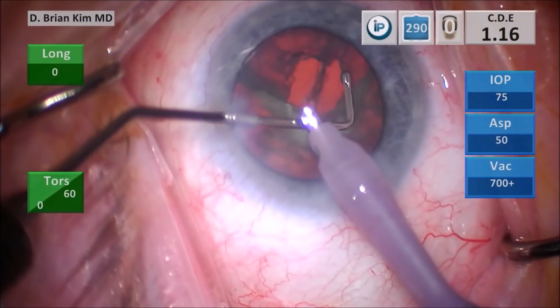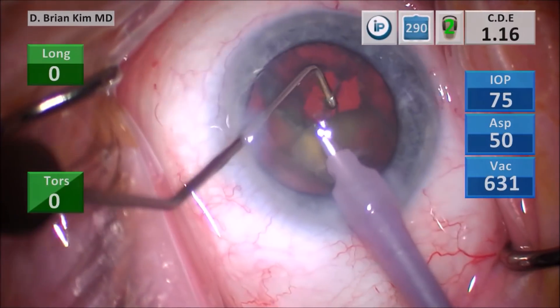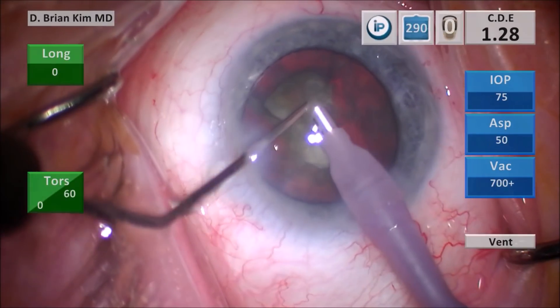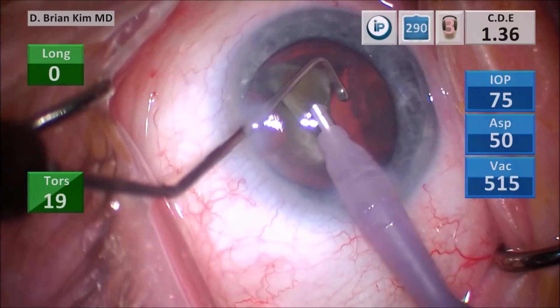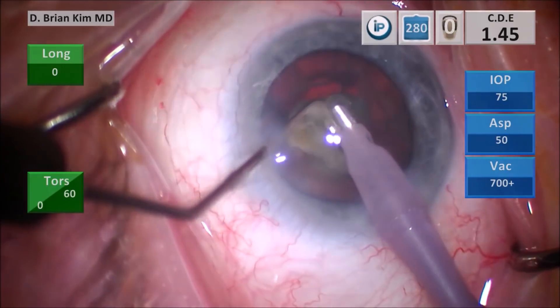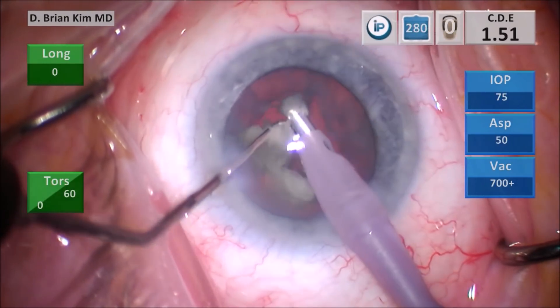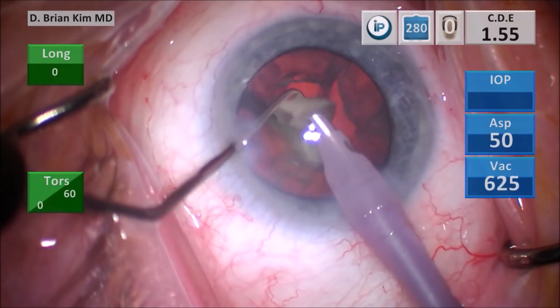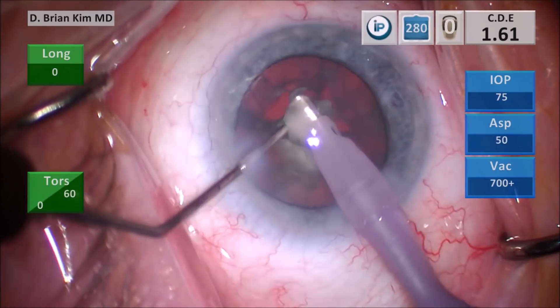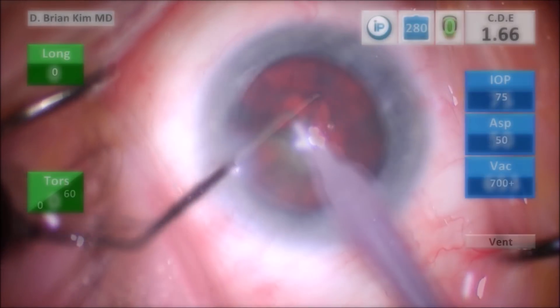Don't ever get in the habit of grabbing pieces with the phaco tip. Go ahead and grab it and pull it into the middle with the chopper. With that piece, it would have been hard to grab with vacuum anyway because it's kind of behind you, and the chopper was naturally positioned to pull that lens into the middle. It's not a good habit to try to grab pieces with vacuum, because if you're grabbing stuff with high vacuum, you can grab the wrong thing close to your capsule. I am directing my phaco tip and chopper around the lens material, then crushing it and making it smaller, then emulsifying and using vacuum in the process. The crushing, breaking, and pulsing minimizes the use of vacuum and ultrasonic energy — because I'm using mechanical forces to break the pieces small enough so I don't have to use a lot of that.